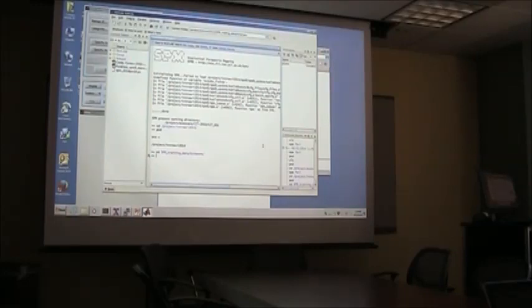The other thing on the horizon is the other scanner, a 1.5T that we don't even have on our radar. Typically it will be upgraded to a 3T, so there will be 2 research 3Ts in the future, so that's good.